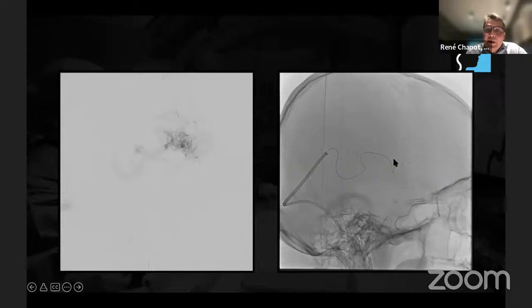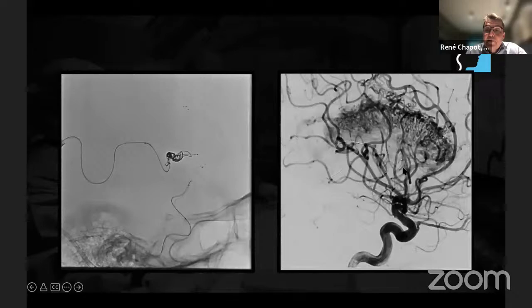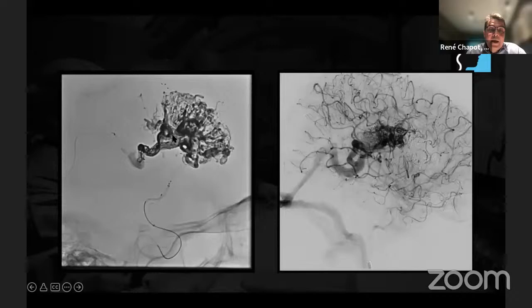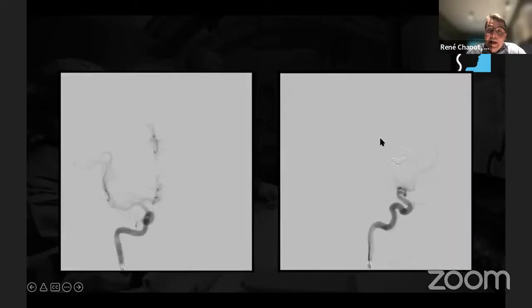So we decided to go to the very anterior vein. Here is the microcatheter. Here we do what we call a retrograde venous pressure cooker to limit a potential diffusion of embolic agents throughout this vein. And then we occluded this part here. You see this is ongoing embolization. And finally, we occluded the whole anterior part, which now is occluded. This is remaining.